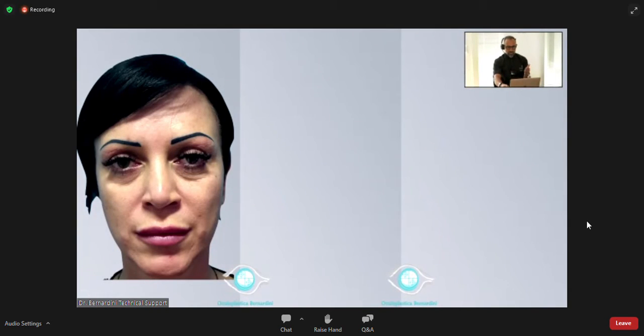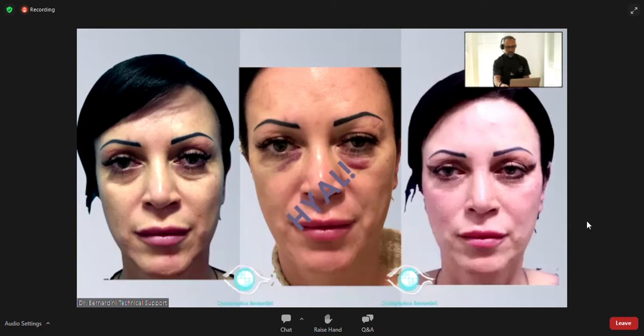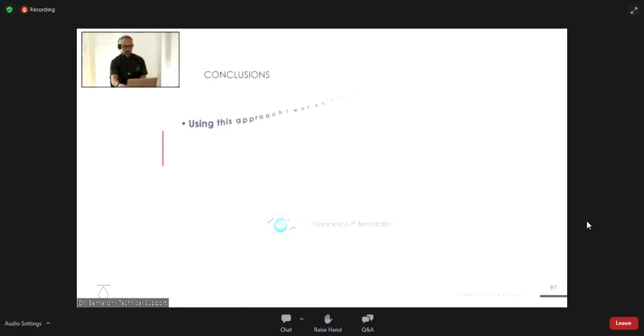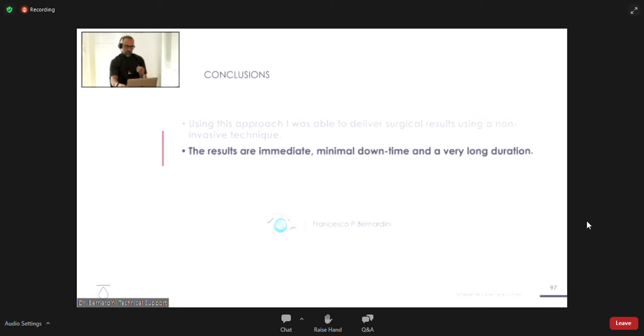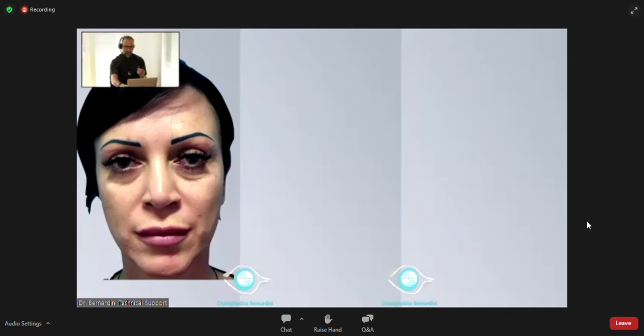Again, another patient of mine, the same technique, different products. I will not say which products, but this is a dentist as well. And this is, again, me having to inject her with hyaluronidase, and then retreating her with the right products, and she got a good result with no complication. So with my technique, I'm connected to this product because I can bring good results using those products only. Compared to, let's start the slide again. Sorry, I want to bring it back.